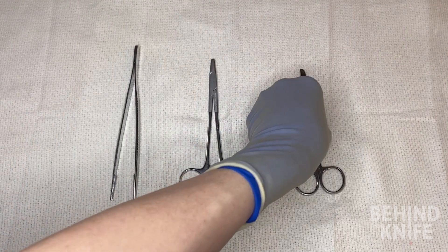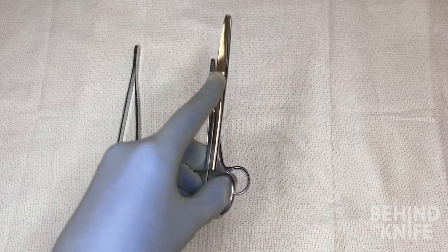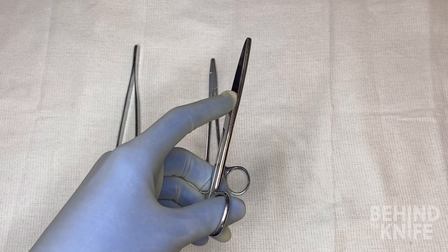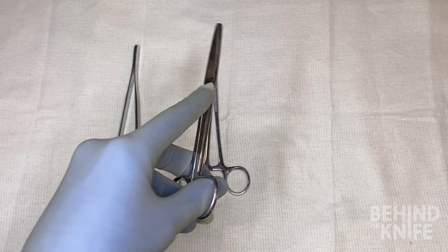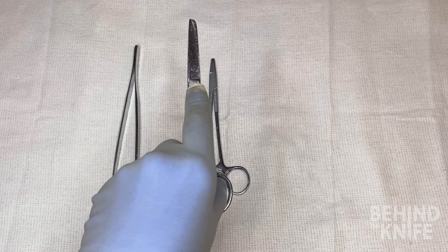Right-handed scissors can be used in your left hand, but will just need to be held in a different way. You'll generally need to hold the scissors at an angle in order to allow them to cut. Once you've gotten the hang of this, there's a good way to use them when it comes to cutting suture.